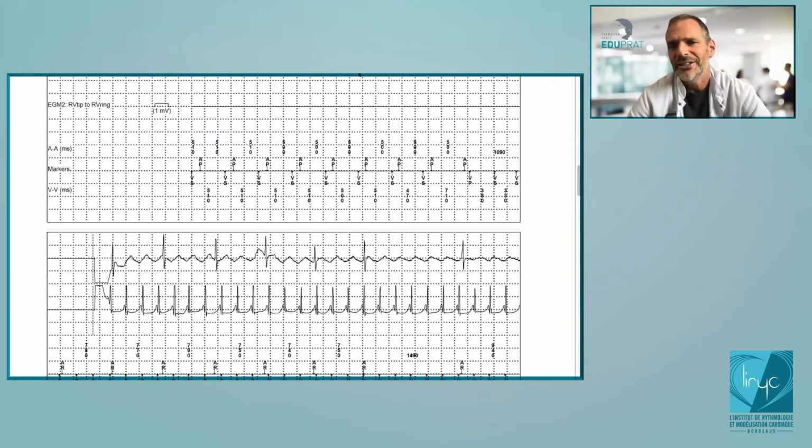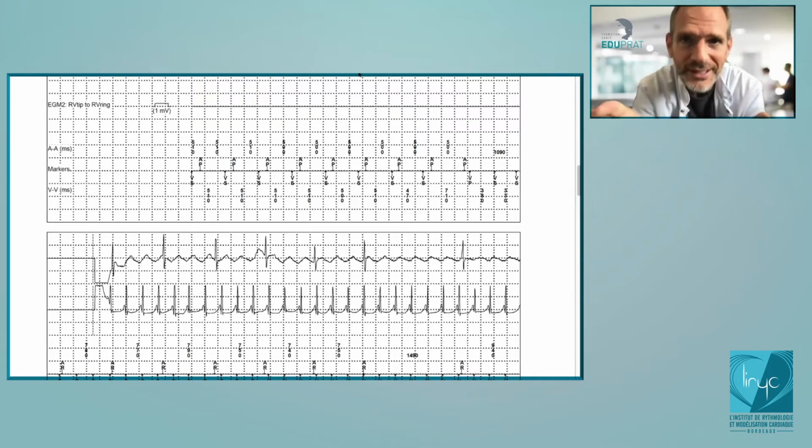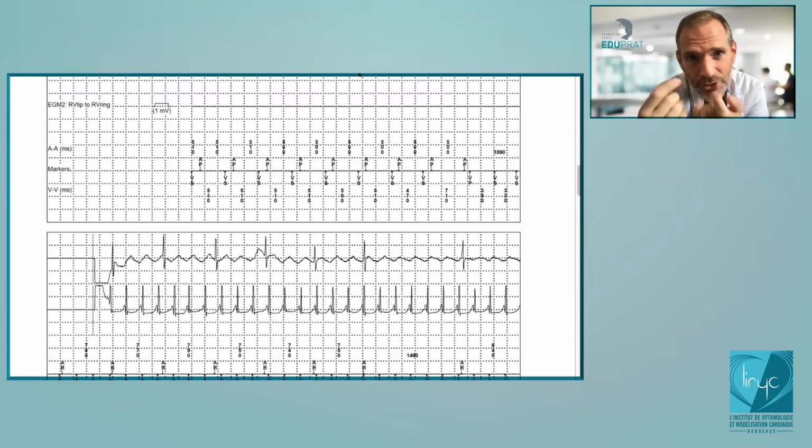But since there are so many Medtronic devices implanted all over the world, there was some recording of arrhythmia like this by ICDs, and you could see the VT. And then when you were looking at the initiation, you could understand that maybe the MVP algorithm was the cause of the induction of the arrhythmia. Okay, that's clear.